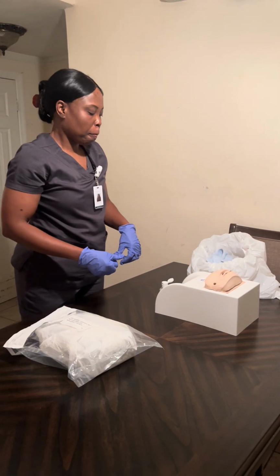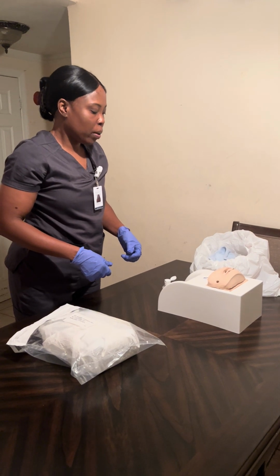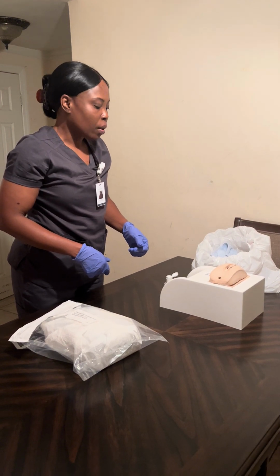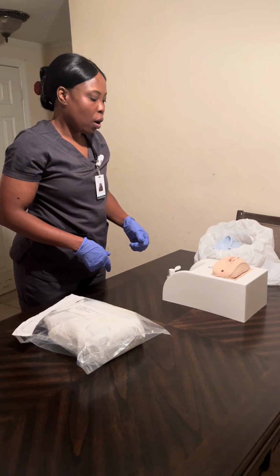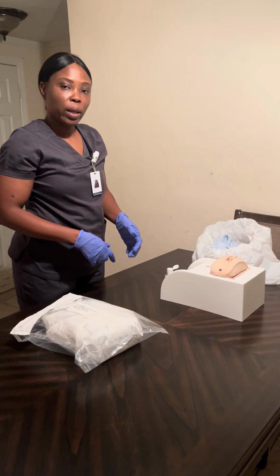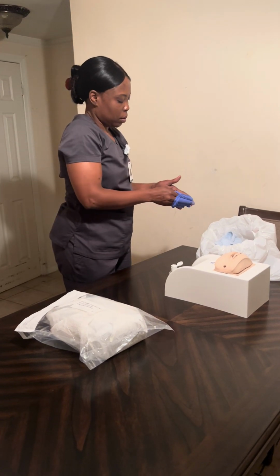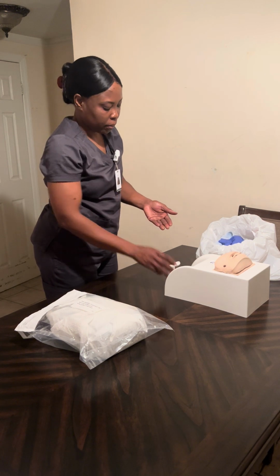Okay, Mrs. Smith. Now I'm gonna check your anatomy. I'm gonna check your meatus. I see your meatus is open. Now I'm gonna check if there is any discoloration, any discharge, odor, smell. Okay, Mrs. Smith. Now I'm going to take off my gloves. Turn it inside out. Turn it inside out. Put it in the trash. I'm gonna sanitize my hand.